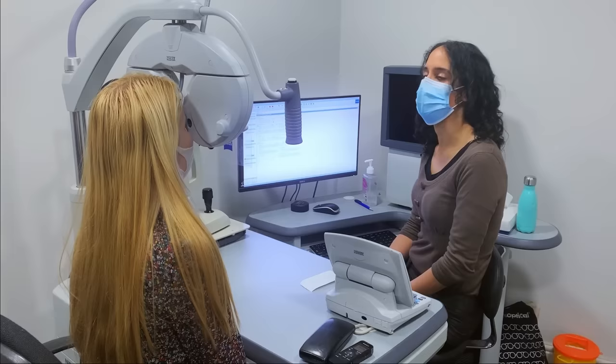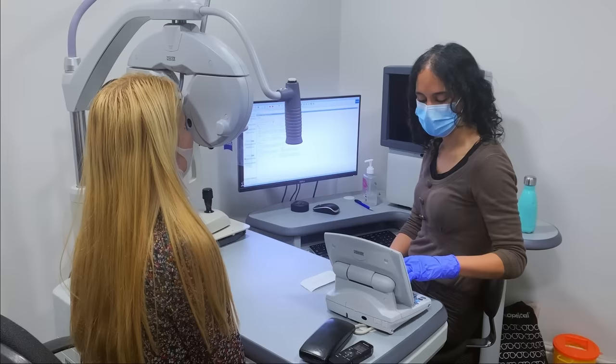Don't worry if you can't. Yeah, no, I can't read the bottom. That's absolutely fine. That's very good. So we'll just swap over and let's do your other eye. Brilliant, have a few blinks.